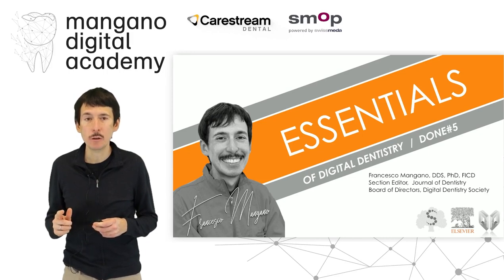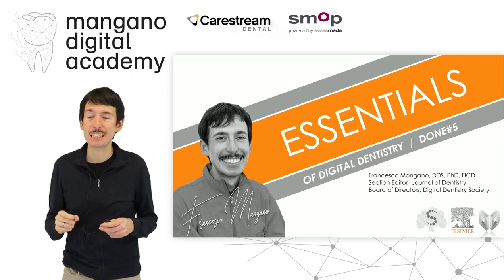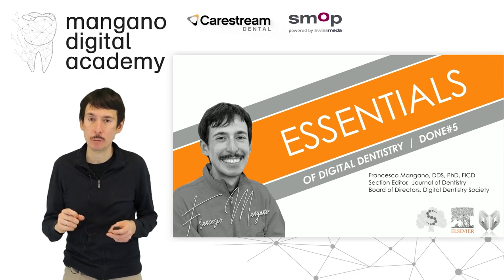In this video of the done phase, for the first time, we talk about artificial intelligence. Artificial intelligence is a very valuable tool for digital dentists all over the world. It's a novel tool, very promising, and it is already extremely helpful to change our profession, to save time and to work in a very predictable way.